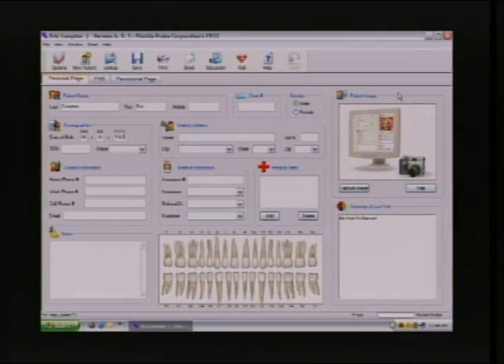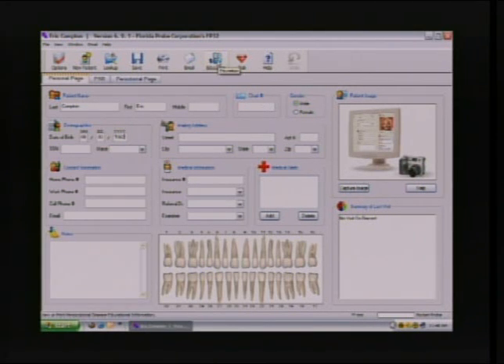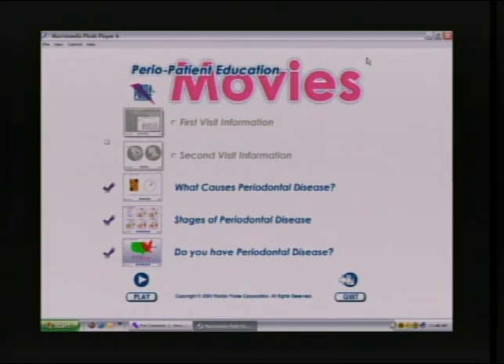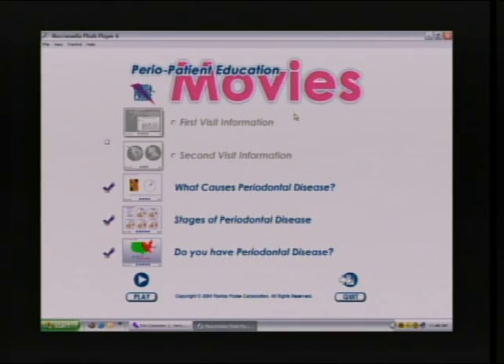Step three is a patient education component, and here on your desktop there's a movie icon — that's the link to the patient education. There are five one-minute movies specific to periodontal disease that reside within Florida Probe.